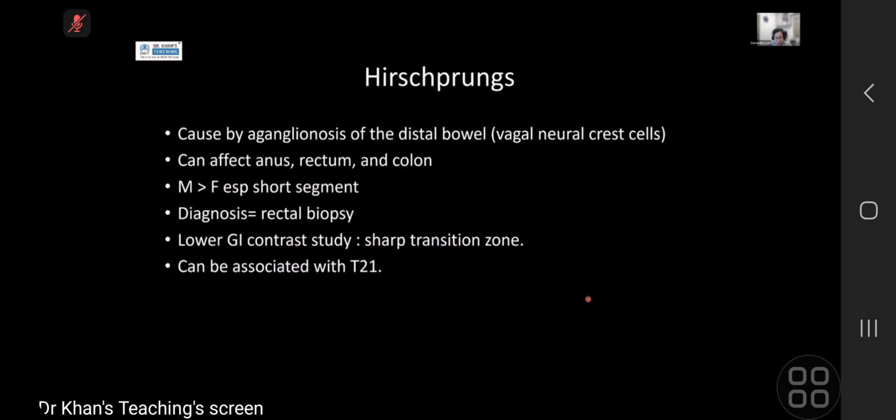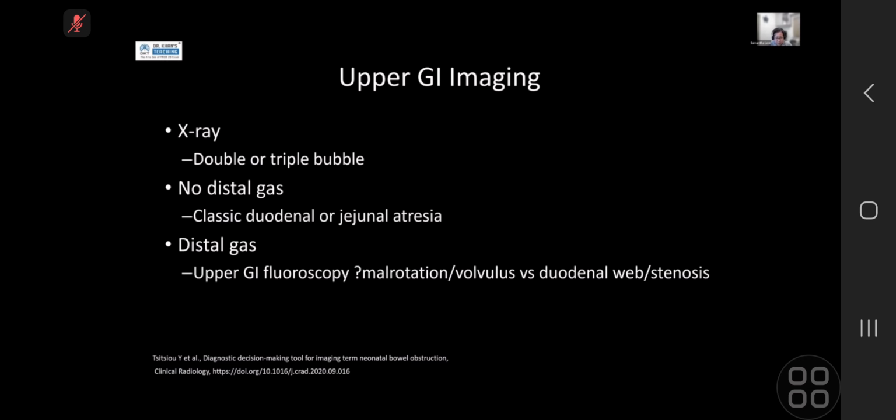So similar to the other causes of lower GI obstruction. Okay, I know I've been quite fast here, so this might be a short session, but certainly if there are any questions, I can answer them during the break or in the next 10 minutes. So it's just a quick summary.